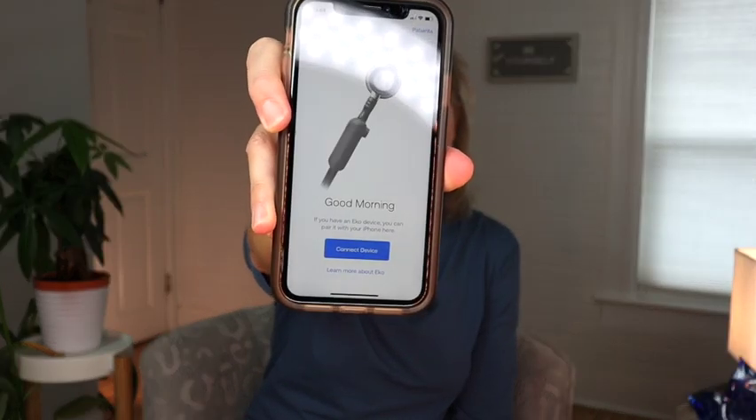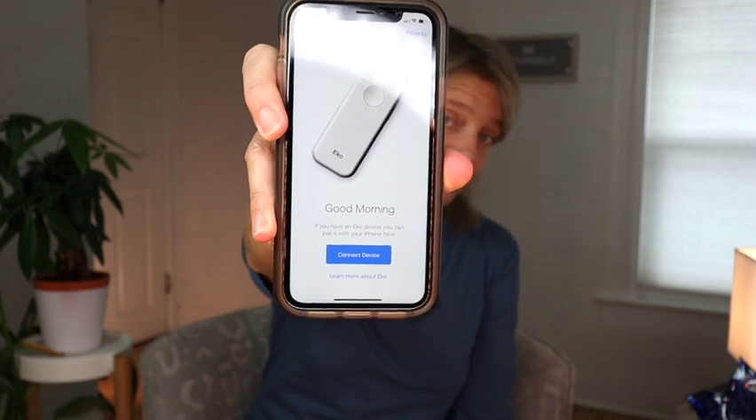Now we're going to get into the setups. The first setup is the earpiece itself with the Duo. If you have mild hearing loss, you could probably get away with this — just take your hearing aids out, put the earpieces in your ears like a regular stethoscope, and listen that way. It's not a setup I'll use because my hearing loss is pretty significant. I have sensorineural hearing loss, acquired, with severe to profound hearing loss, so I need to connect directly to my hearing aids.